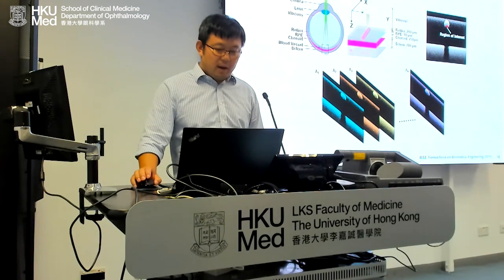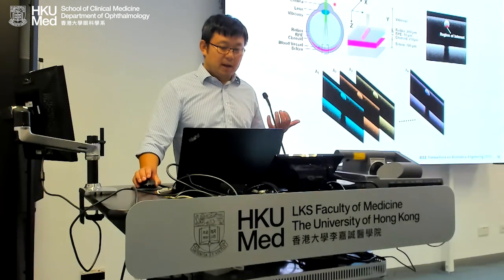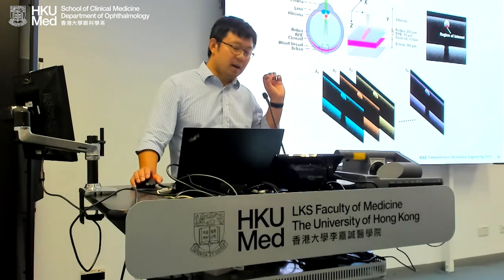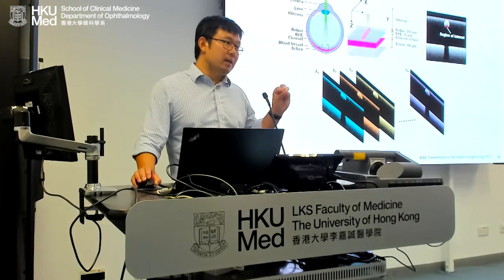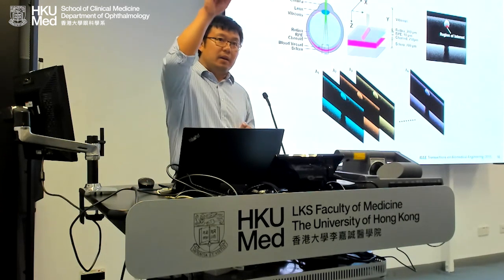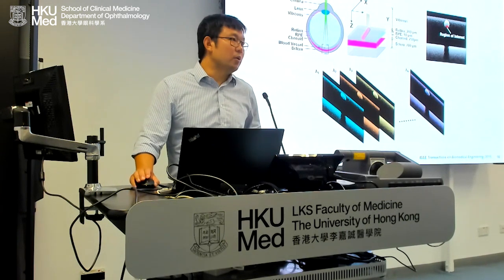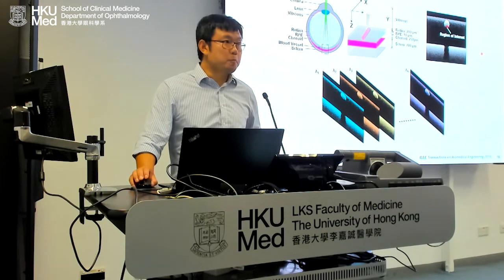So the first thing is, numerically, we want to simulate that. We build an eye model. This is a numerical model. We shine light through the regular path, like any eye, and create a vessel model. So it's a vessel embedded in multiple layers of cells. Light coming in bounces back at different locations and then we reconstruct, like I mentioned, that's the OCT process. So this is the simulated OCT image.